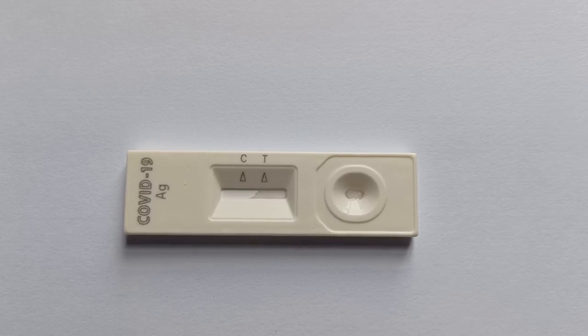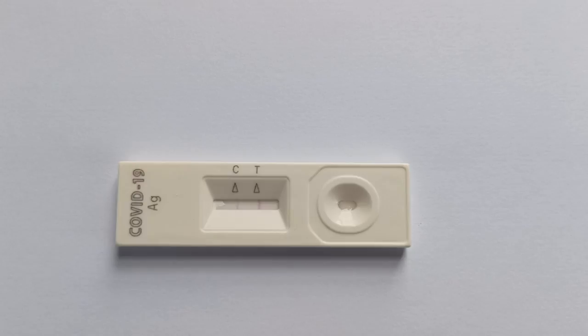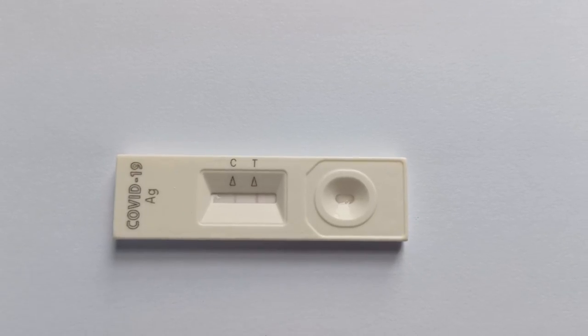Make your final observations at the end of 5–10 minutes. In the case of a sample that tests positive for COVID-19, two distinct purple lines appear on the spots labeled as test or T and control or C on the test cassette. As long as a purple line shows on the test spot, no matter how faint, it is typically considered a positive test.